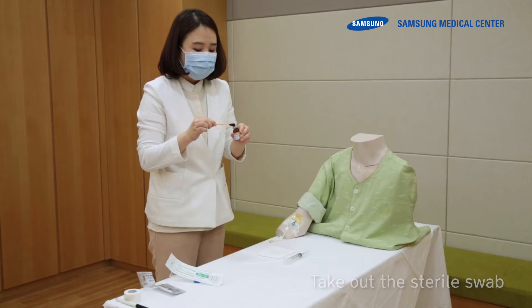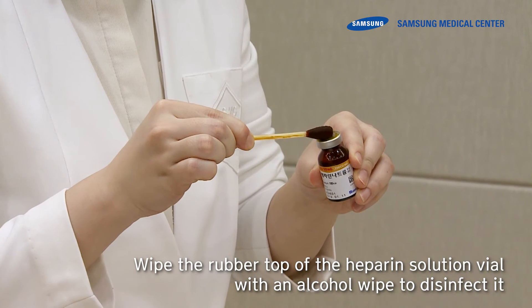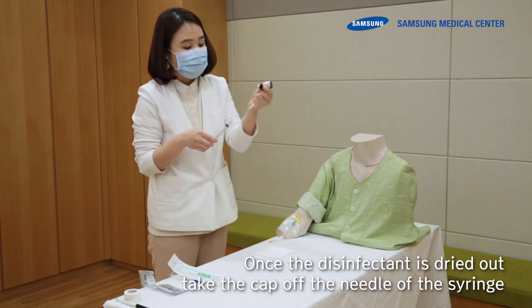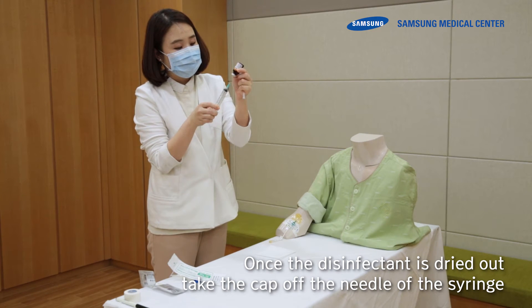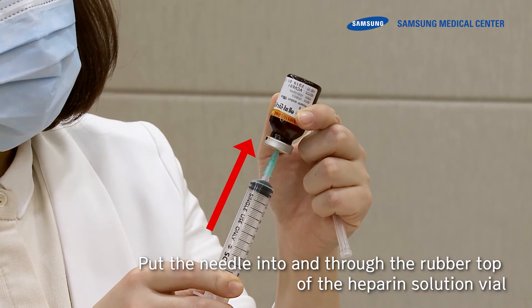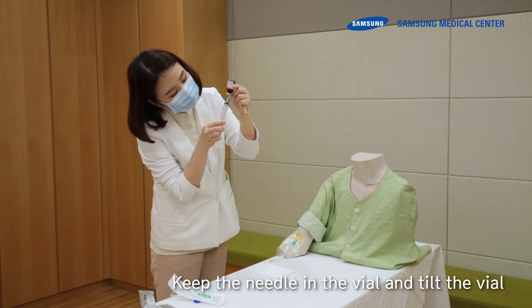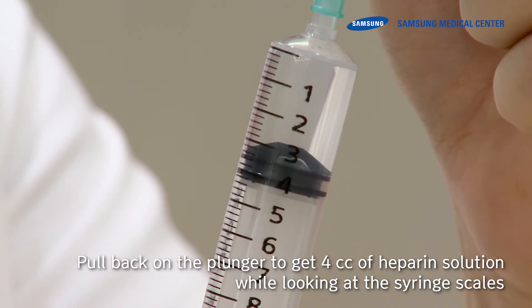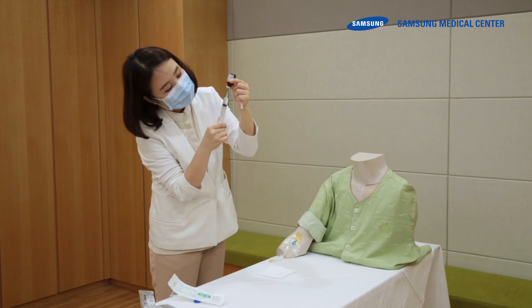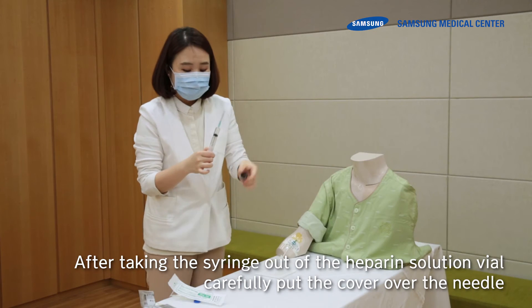Take out a sterile swab and wipe the rubber top of the heparin solution vial with an alcohol wipe to disinfect it. Once the disinfectant is dried, take the cap off the needle of the syringe. Hold the heparin solution vial, put the needle into and through the rubber top, tilt the vial, and pull back on the plunger to draw 4 cc of heparin solution while watching the syringe scales. After taking the syringe out, carefully put the cover over the needle.